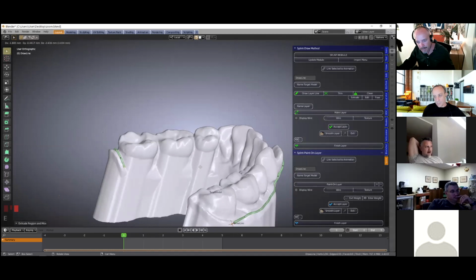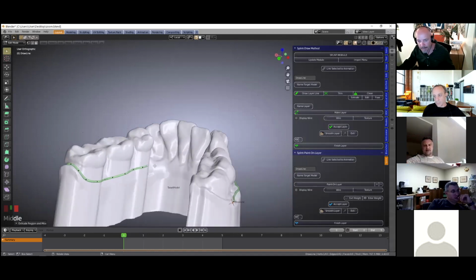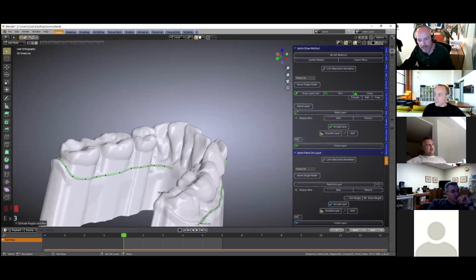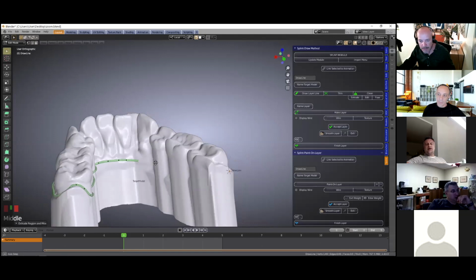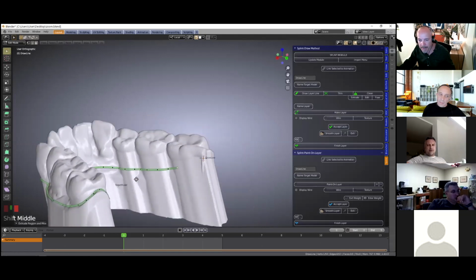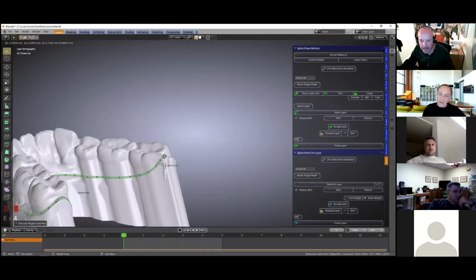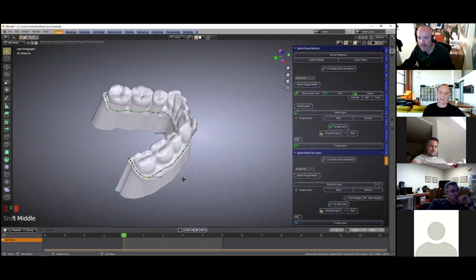Which kind of hard material would you suggest for a hard plane? It should be about 1.5, 1.6 millimeters high. I've used... have you heard of Pro 3D Ure? They've got some really good resins.